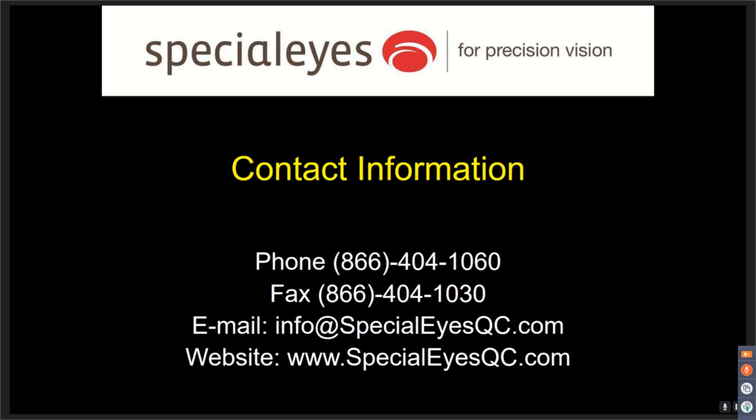With this lens, I'm going to take all the information. I'm going to take the manifest refraction, the topography, the HVIDs. We're going to take the pupil sizes. We're going to take that information and very quickly design the lenses, and that will be the first trial lenses. Then those go on the patient, we wait until they're acclimated, we take acuities, and then we refine it from there. So from the chair time perspective, these custom lenses are actually way quicker than a pre-made lens.